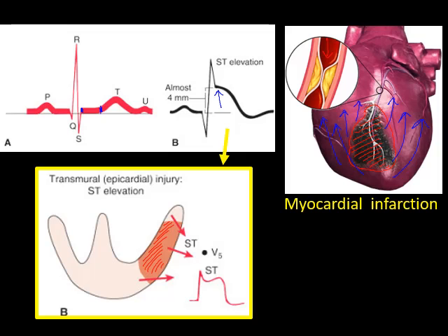The ECG trace will change over time according to how near or how far away from the heart attack the trace is actually generated. But an elevated ST segment could indicate that there's damage to the heart tissue, and the wave of depolarization can't spread up through the ventricle walls as easily, and so there's an elongation of this portion of the ECG trace.